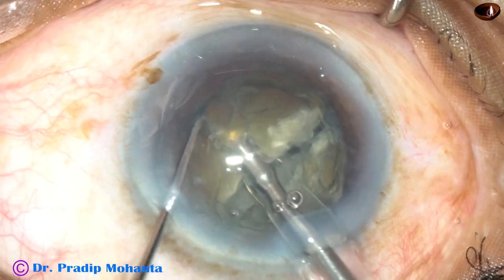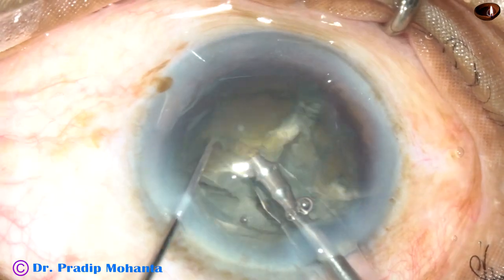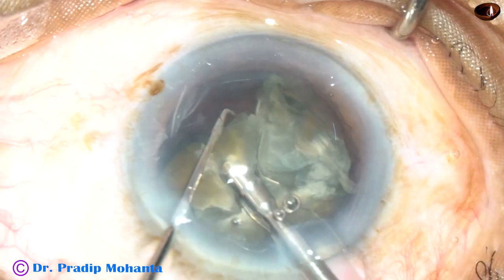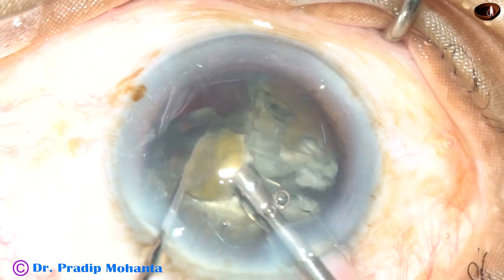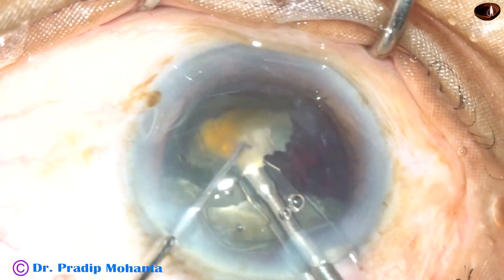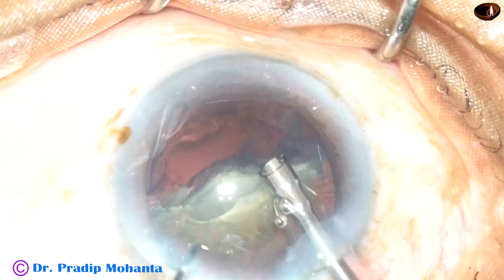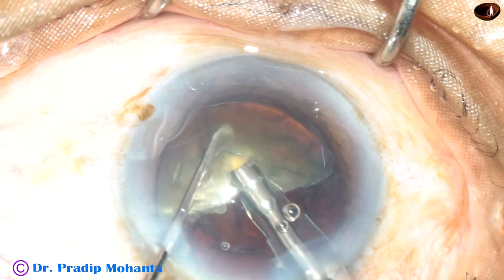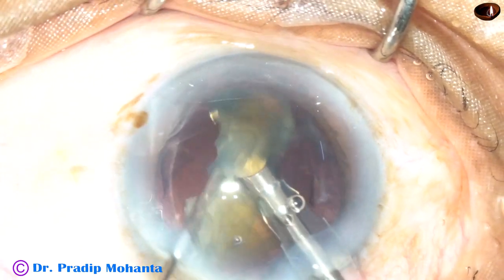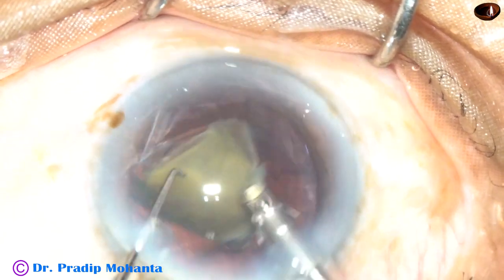So it is not difficult to use a 2.2 mm tip. The surgery is a little slow, but not very slow. The pieces are emulsified. I am using continuous mode. Phaco power is 70%, flow rate is 45 ml per minute, vacuum is 450 mmHg. The chamber is very stable and there is no surge.